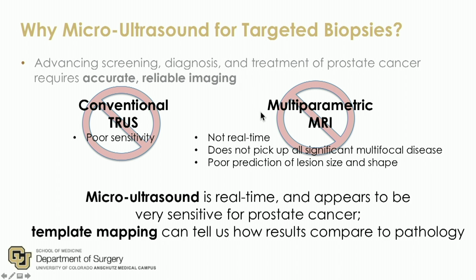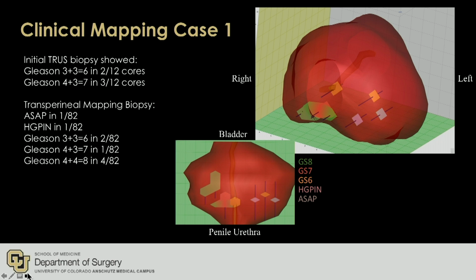Micro-ultrasound is real time and appears to be very sensitive for diagnosing prostate cancer. So what we did is we have done 600 or so template mapping biopsies. Dr. Stone's going to talk about those tomorrow. And Dr. LaRosa, who's sitting in the middle of the room, is our pathologist, with Priya Warahara, who worked very hard when we gave them 150 biopsies to look at, and then put those together in 3D. So what we wanted to do is see how the micro-ultrasound performed in our mapping biopsy population.